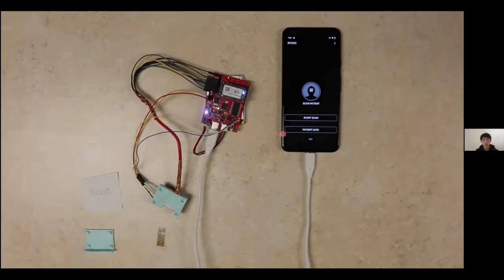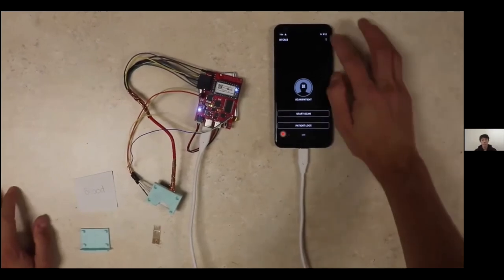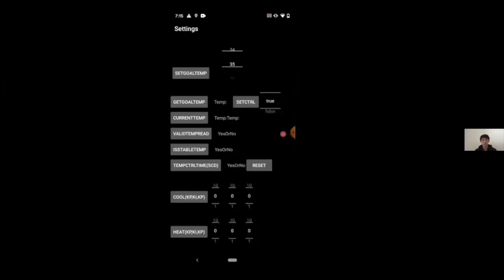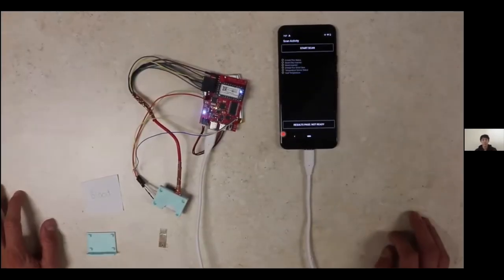We're going to take you through a demo scan of our system. We're currently in the initial state of our app, but we'll take you to our developer options where we can change the variables of the microcontroller. Here, we're changing the goal temperature, and we're setting this to 32 degrees Celsius. Here's our acknowledgement back. Now what we do is we click Start Scan.